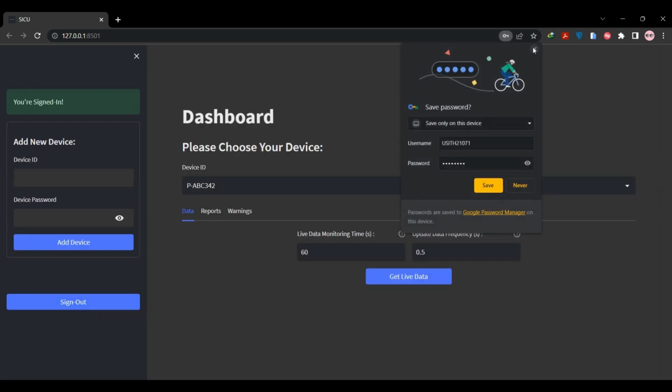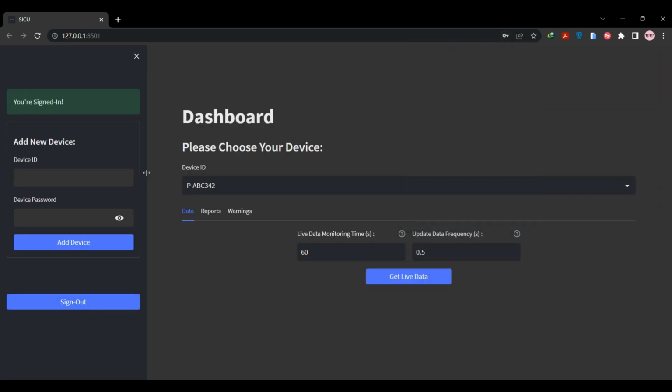After a successful sign-in, you can see your dashboard and private area. Like what we did in the Telegram bot, you can see an add new device section on the sidebar, and you can just specify the device ID and its password in order to add a new device. Here also you can see on the main page of the dashboard that we have a device ID with the name of the ID that we previously added into the Telegram bot.